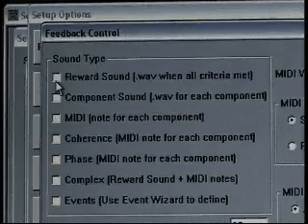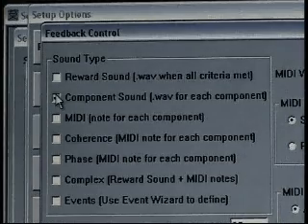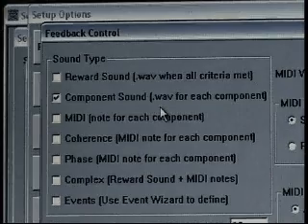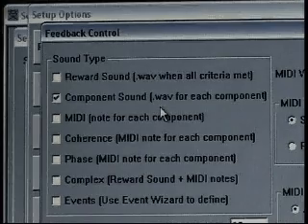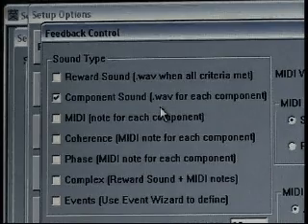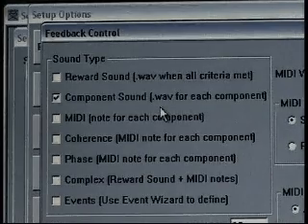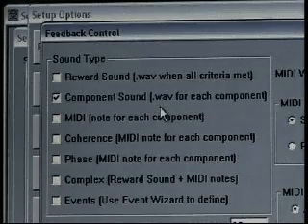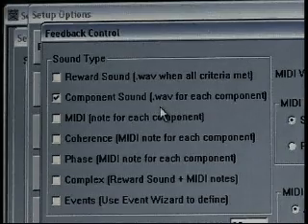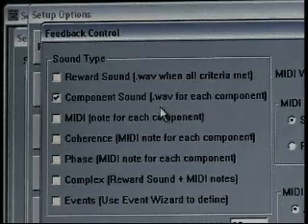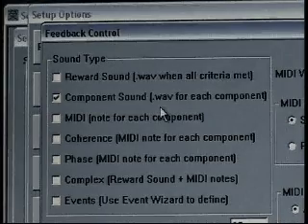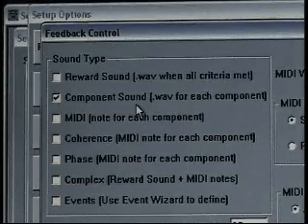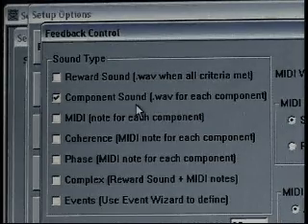Turning reward sound off, if we chose component, we notice the definition slightly changes. It's a dot wave file for each component. So there'll be one sound for theta, one sound for beta, and one sound for high beta. These sounds tend to be nature sounds — there's tree frogs, crickets, and so forth.